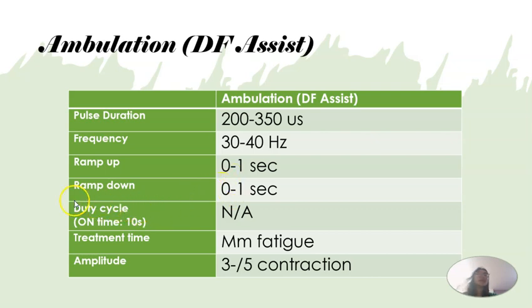As you can see, duty cycle, just like your upper extremity function, depende kung gaano katagal ni patient kailangan yung dorsiflexion. Okay? Baka kailangan niya lang for about 3 seconds. Pwede din man. Or 2 seconds lang. Mabilis pala siyang maglakad, pero may konting improvement lang na kailangan for dorsiflexion. So, depende pa rin ang duty cycle ninyo sa ability ni patient, or sa how quick the patient could do the task.